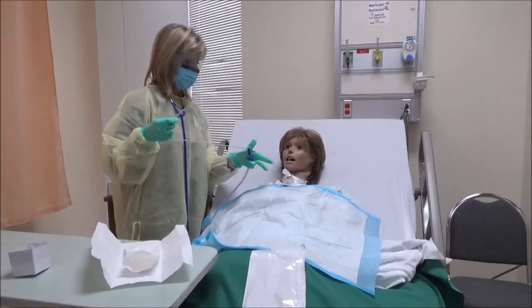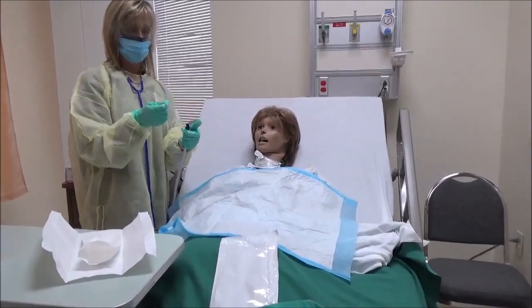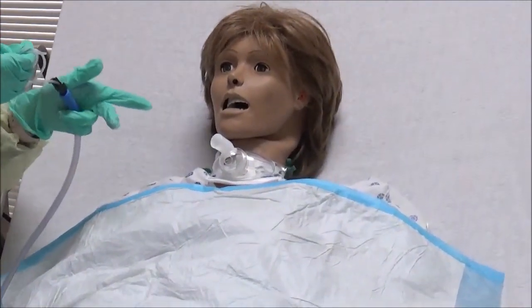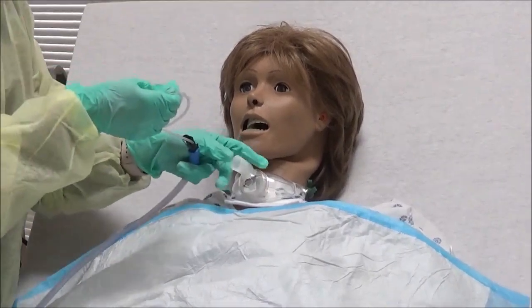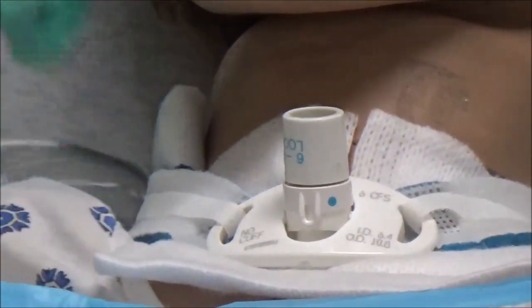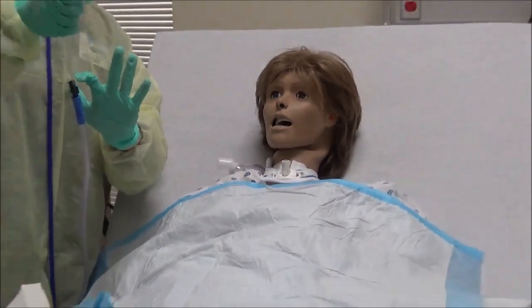Now, my client has oxygen, and in your guidelines it says that we should hyperoxygenate the client with a trach collar for 30 seconds. I've been doing that for more than 30 seconds. So now I can remove the oxygen source. I'm going to unhook that. Remember, this hand is not sterile and it can only touch from the black part down.